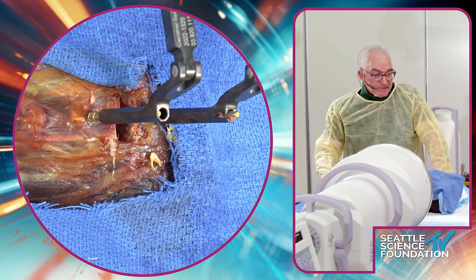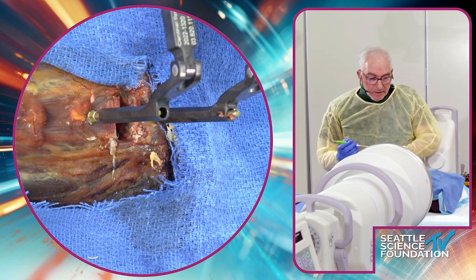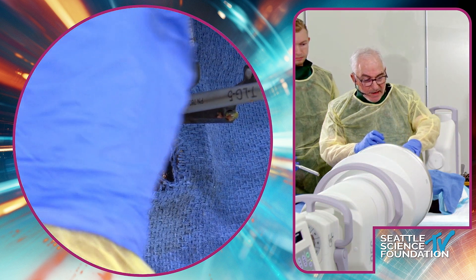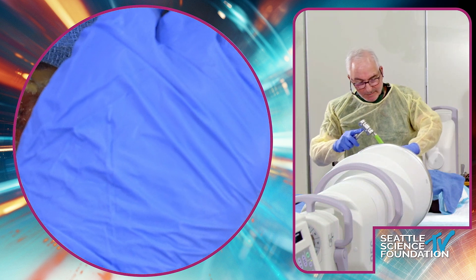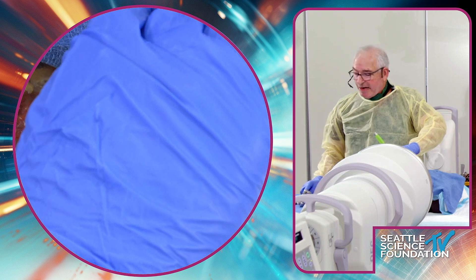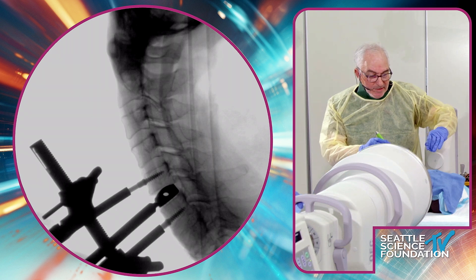You can either preoperatively template the disc space like you would for an index case, or once you've taken out the prosthesis you can just read the size on it. We know it's 16 millimeters deep, so I'm going to trial a 16 millimeter deep Simplify. I've got about three to five cases where I've revised to Simplify — it's got a nice low-profile keel and is a nice revision disc. Trial-wise this is fine; the disc we took out was five millimeter height, so this is five millimeter height as well.